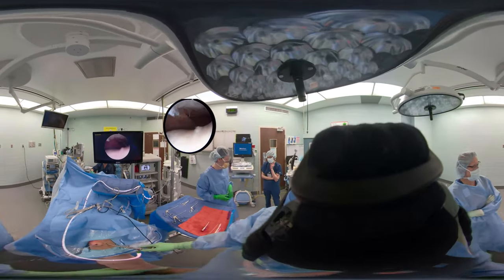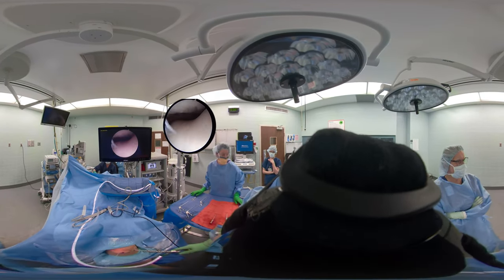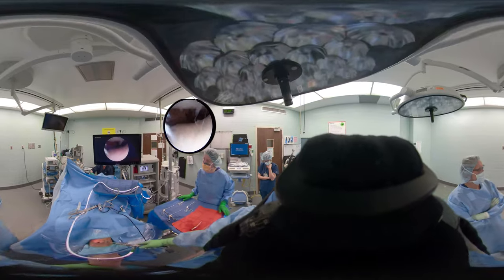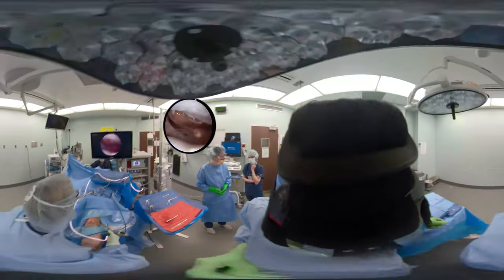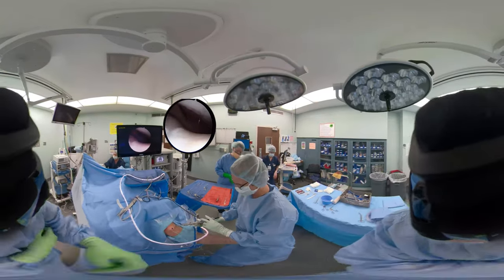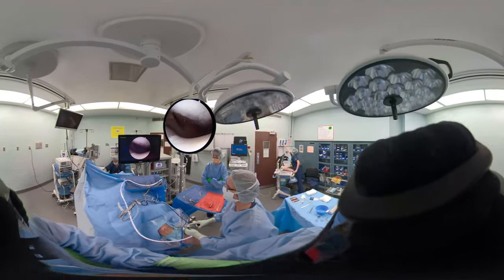Now we put the scope back in the lateral portal and we're watching how the patella tracks. You can see moving the knee — flexion, extension — and see how the patella tracks. She had one single dislocation. We're assessing whether she might be a candidate for further surgery with a patellofemoral realignment. But with a single dislocation and a loose body, we don't need to do any major open realignment procedure.